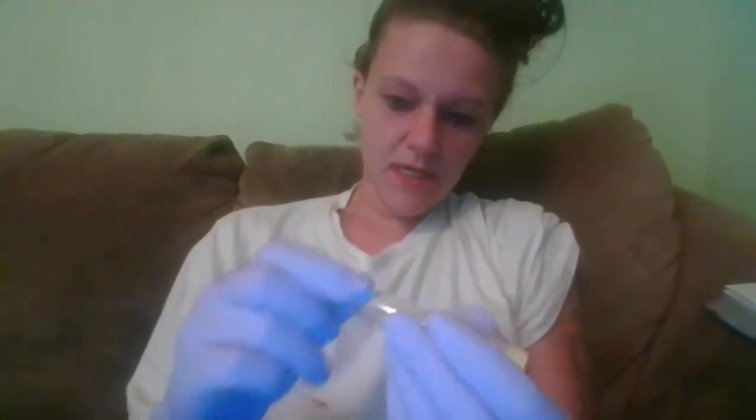Then once I have the needle in the vein, I'll start applying my vacuum tubes into the tube, which then should produce the blood flow. Now, you don't want to do this procedure too slow because you need to go ahead and get the blood and then remove the tourniquet because you can cause the patient's blood to start clotting, which is not good for anybody.